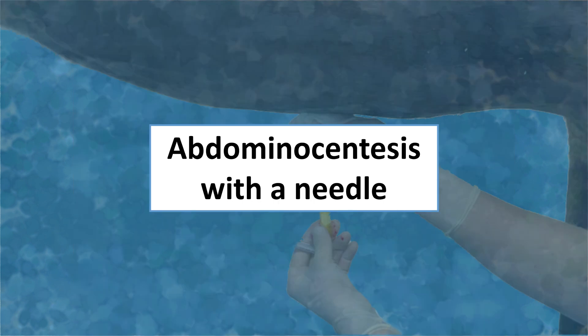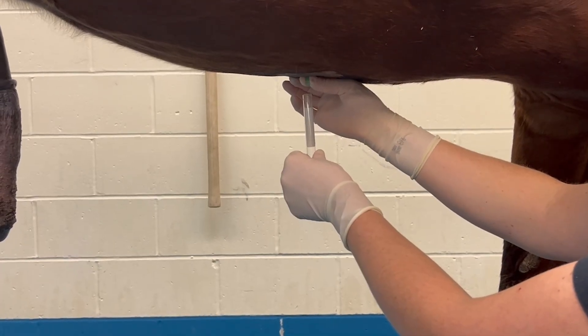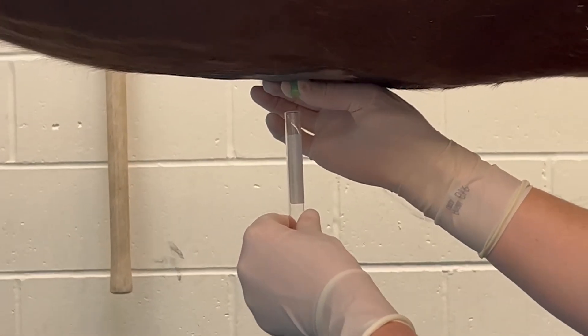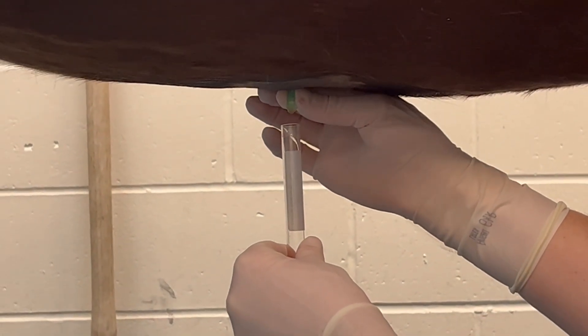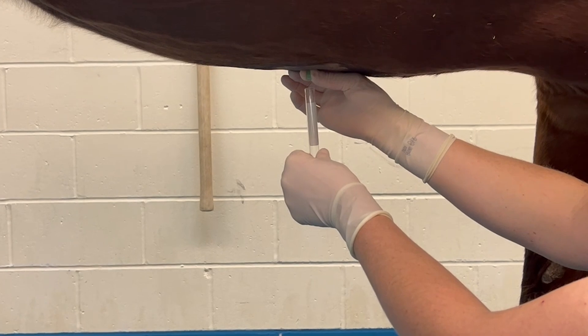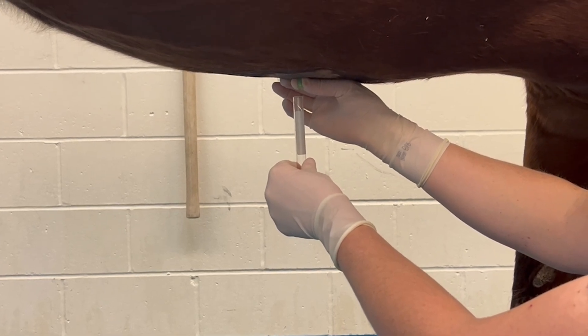Next we'll discuss using an 18 gauge needle for abdominocentesis. Reasons you may choose this over a T cannula include horse temperament, having fewer people available, a very painful patient, or in foals. The steps for clipping and aseptic preparation are the same except blocking the skin is generally unnecessary. The needle is inserted in the center of the aseptically prepared square and advanced until fluid flows freely into the collection tubes. Needle abdominocentesis tends to be less successful in large patients with significant body fat. If unsuccessful, consider switching to a T cannula as its longer size may allow better penetration of the body wall. It is not recommended to use a longer needle. You may need to spin the needle, as with the T cannula technique, to allow free flow of fluid.